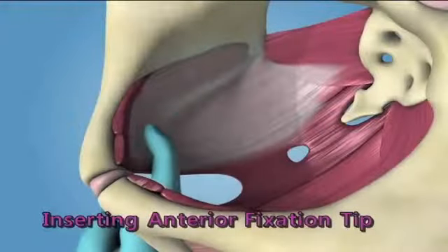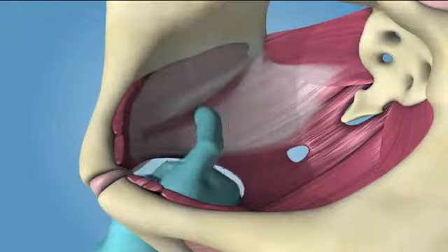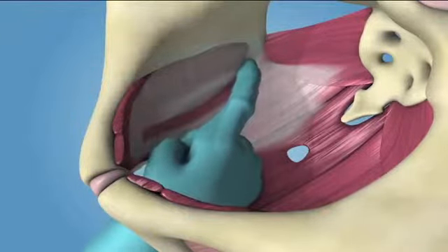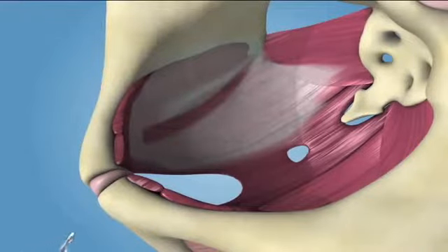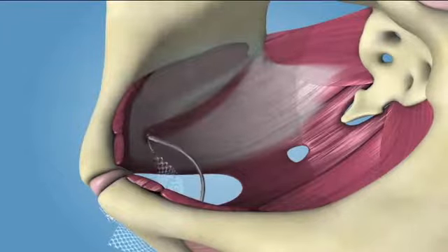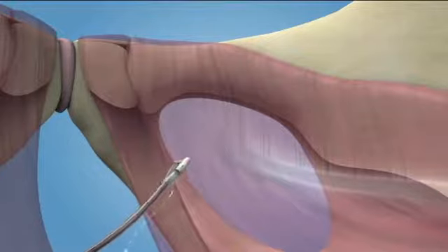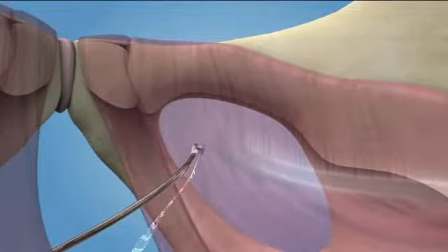Inserting the anterior fixation tips. Aim the anterior needle tip towards the obturator foramen approximately 1 centimeter medial to the ischiopubic ramus, while holding the needle curve against the index finger. The needle trajectory should be horizontal to the bladder neck. Using a lateral arcing motion, guide the needle around the backside of the ischiopubic ramus. Then, pivot the handle to ensure the fixation tip approaches perpendicular placement into the obturator internus muscle.